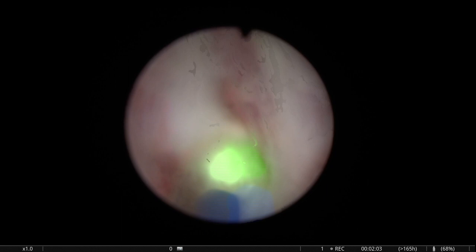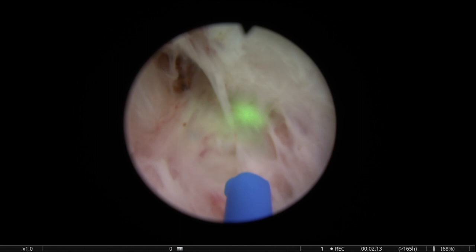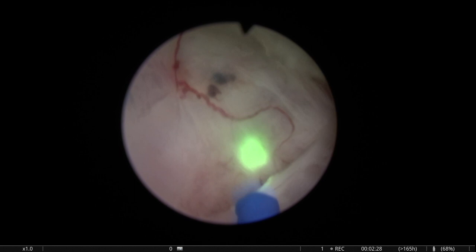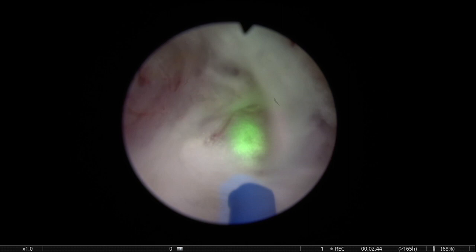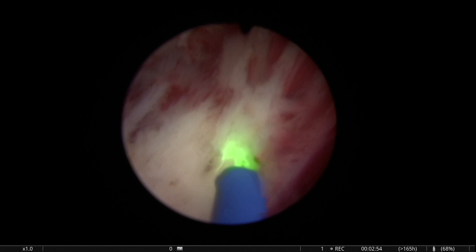So you see there will be a difference in the way this laser behaves in comparison to normal Holmium with higher energy settings and higher frequency, like the 250 we usually use. And you will see that there is still more difference with the pulse modulation lasers that are now available, that provide much better cutting and coagulation. This low power allows you to dissect, allows you to coagulate, but I think it's possibly a slower laser, and sometimes we face difficulties with hemostasis of the large bleeding vessels.